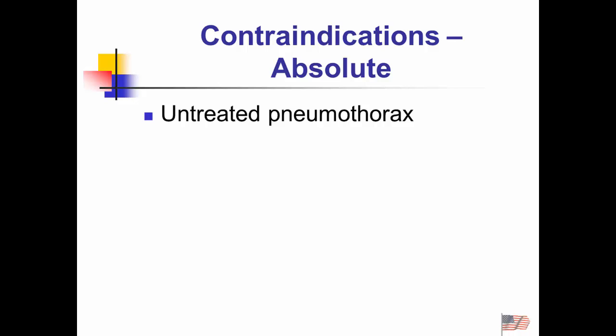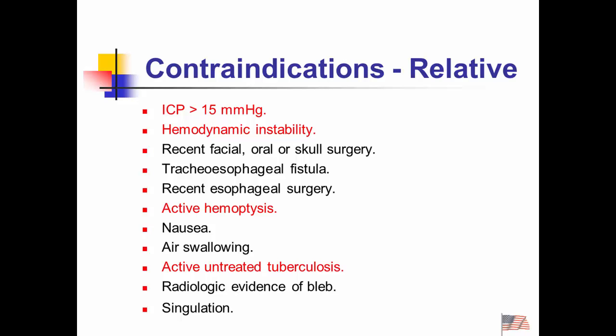Absolutely, do not use this if you have an untreated pneumothorax. End of discussion. That is the classic question of what is the absolute contraindication to IPPB or positive pressure in general. There are many relatives.